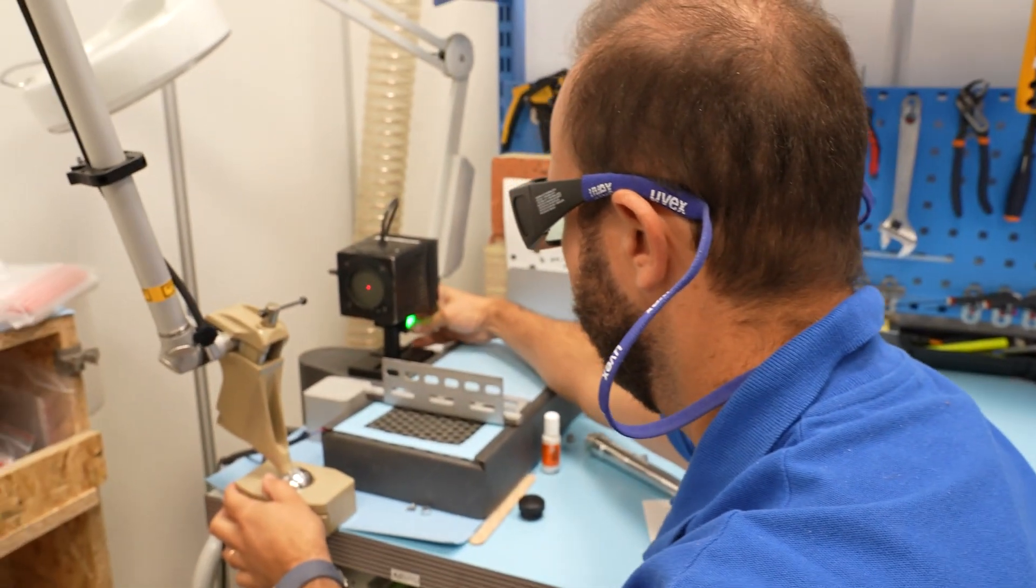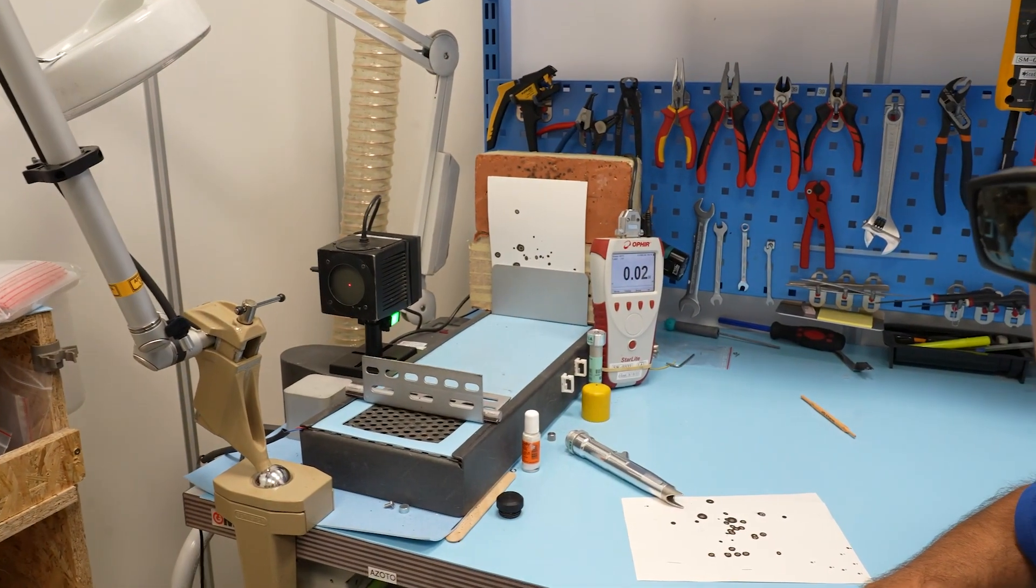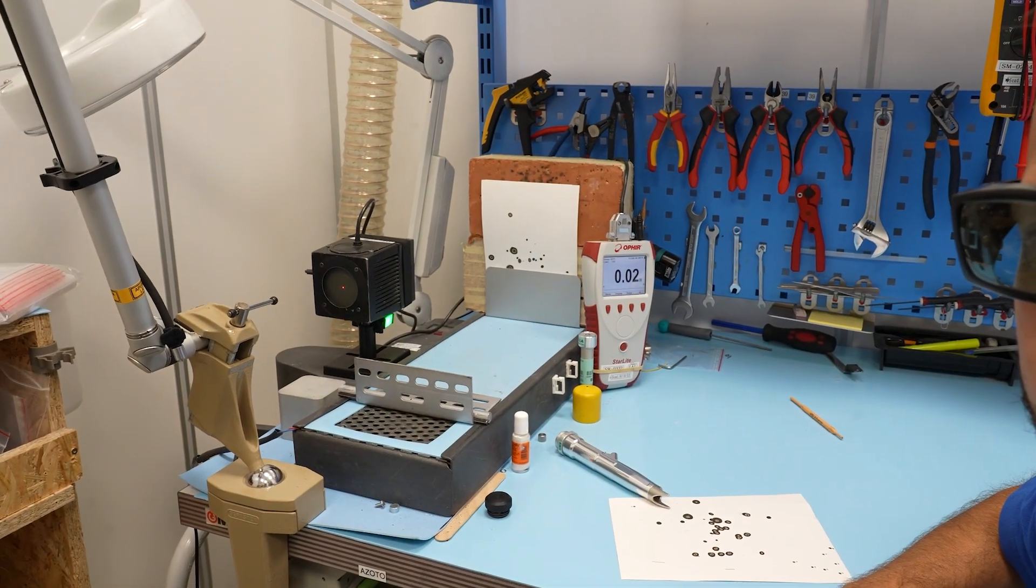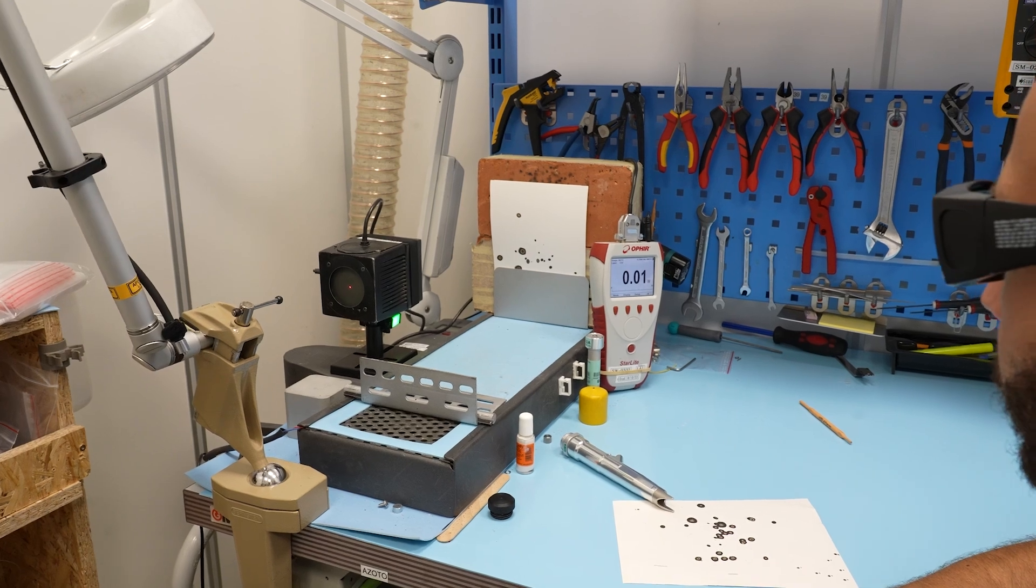For example, in this moment, we test the power of the CO2 laser.